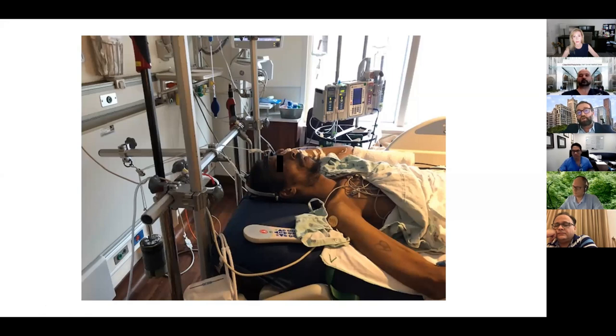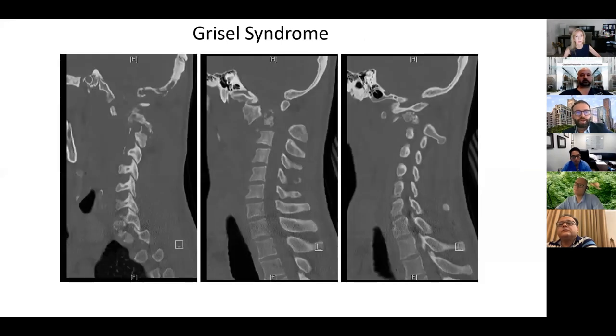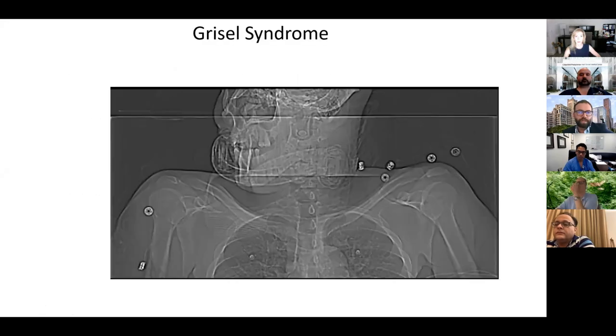Great. So I go with the condyle-C1 index. If that's low, then you know that the joint capsule at the condyle-C1 joint is pretty intact. Let me go back to the images here. That's a great question. So I'd never put a patient in traction who has an AOD dissociation. But when you look at this, see, the condyle-C1 index is low. Here it's destroyed, but it's not dislocated. You know what I mean? So I'm comfortable putting patients in traction with any pathology except for AOD, atlanto-occipital dissociation or dislocation, or atlanto-axial dislocation or dissociation.